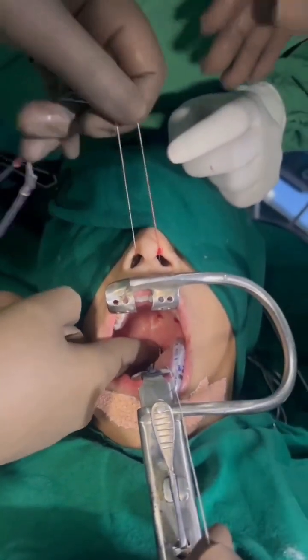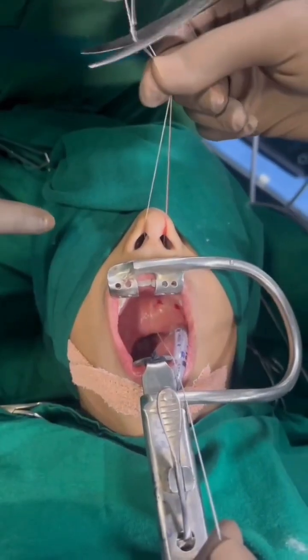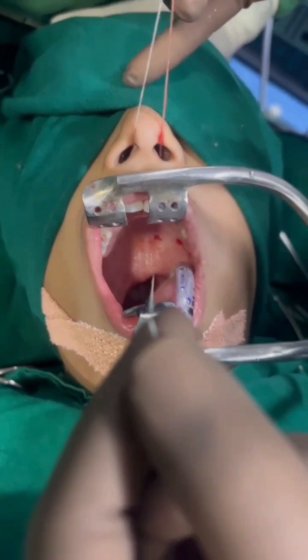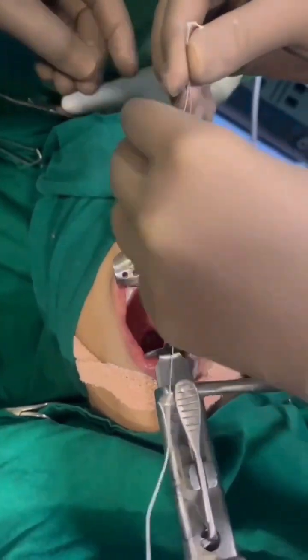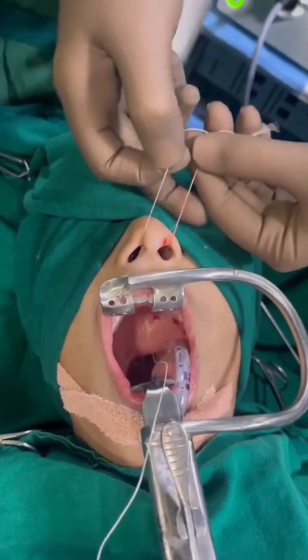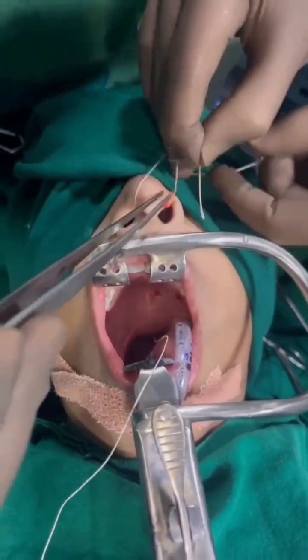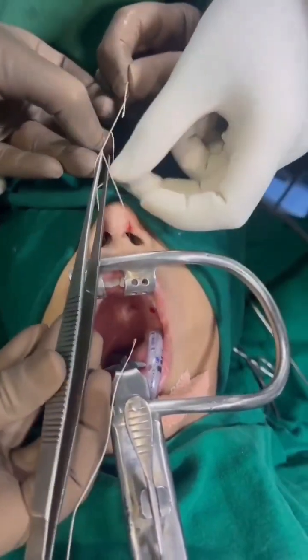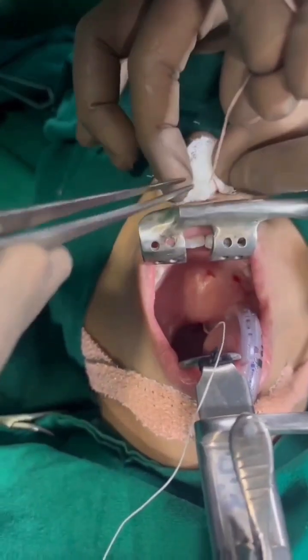Now both infant feeding tubes are out with the threads. We cut the threads from the tube. This is how we do a posterior nasal packing — the pack has gone behind, the one thread is coming out of the mouth and two threads are outside the nose. We tie a knot for the two threads so the pack does not fall into the oropharynx, and we keep a small gauze at the philtrum of the nose so that the thread does not damage the soft philtrum.